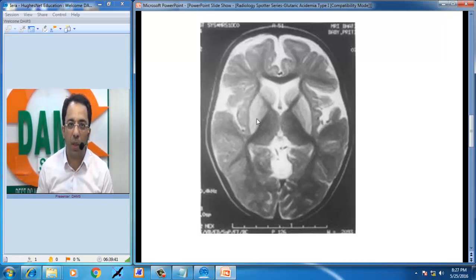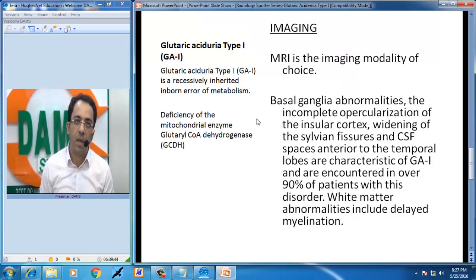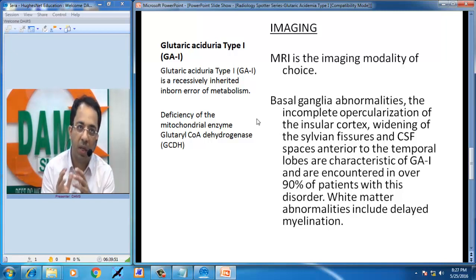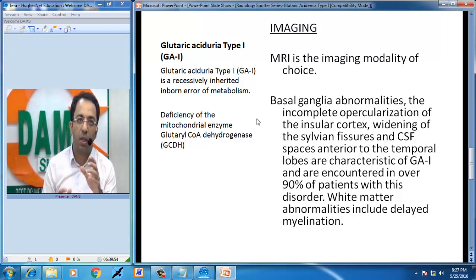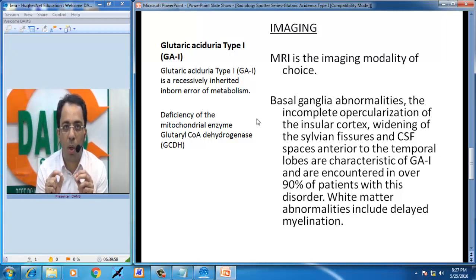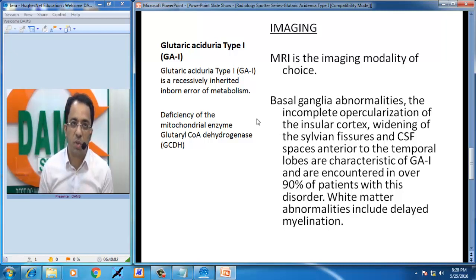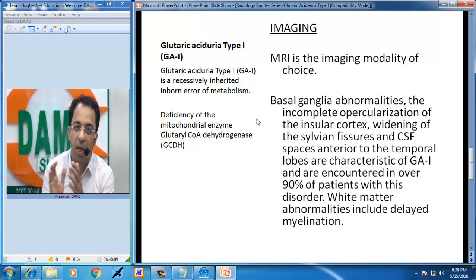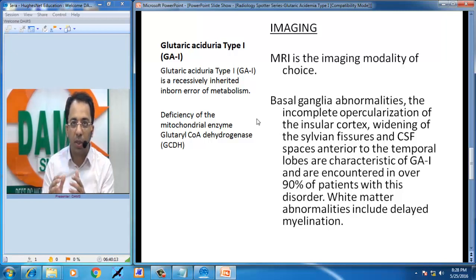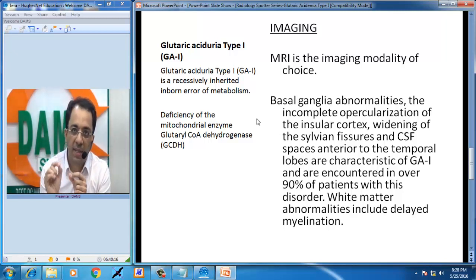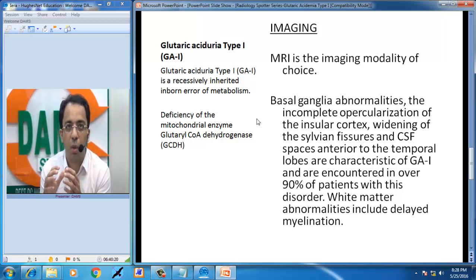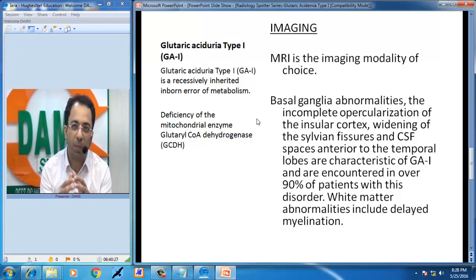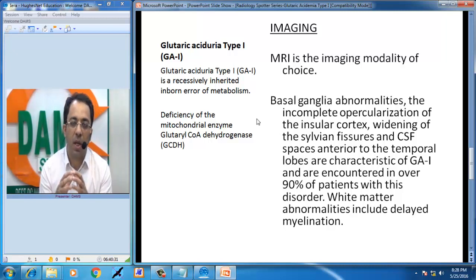With a history suggestive of an inborn error of metabolism, these are the typical radiological findings of glutaric aciduria type 1. This is a recessively inherited inborn error of metabolism due to deficiency of the mitochondrial enzyme glutaryl-CoA dehydrogenase. MRI is the investigation of choice, and the key MRI findings are: basal ganglia abnormalities, incomplete opercularization of the insular cortex, widening of the Sylvian fissure, and CSF spaces anterior to the temporal lobes. These are characteristic of glutaric aciduria type 1, encountered in over 90% of such patients. White matter abnormalities including delayed myelination may also be seen.